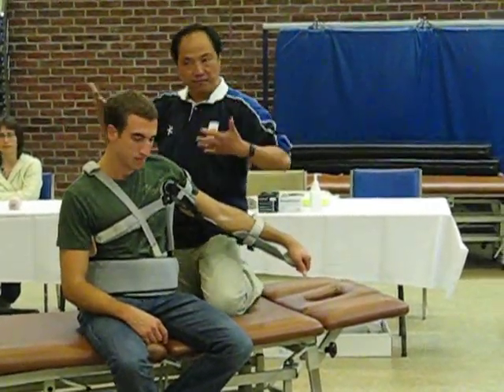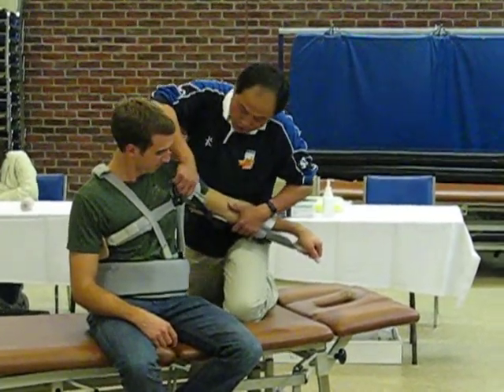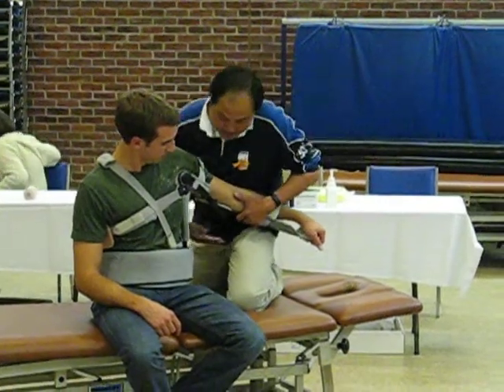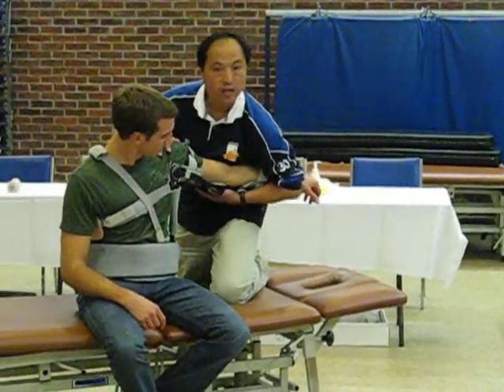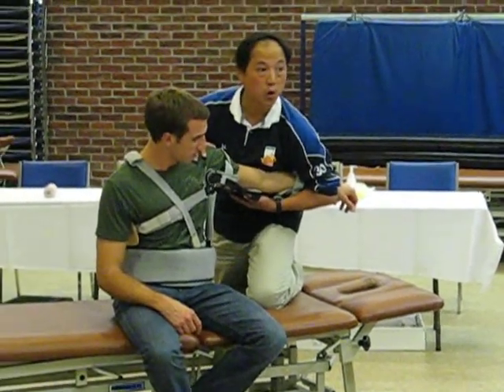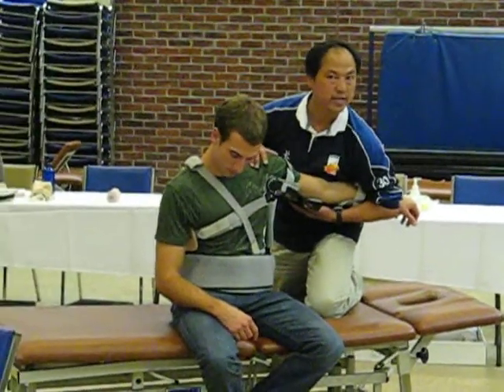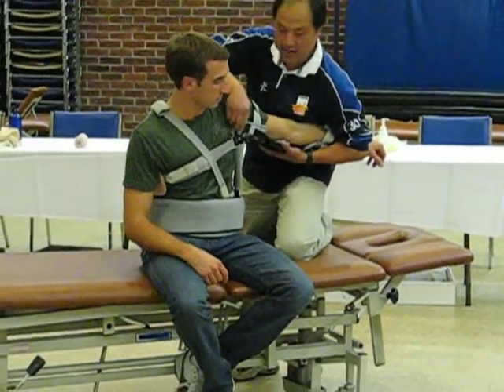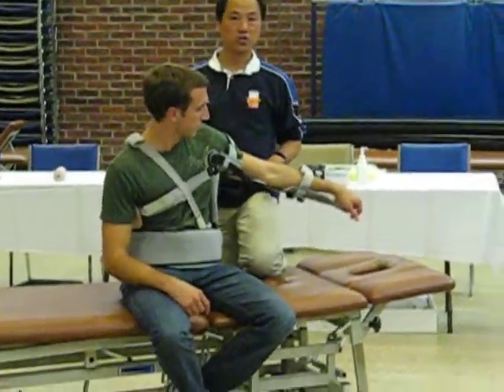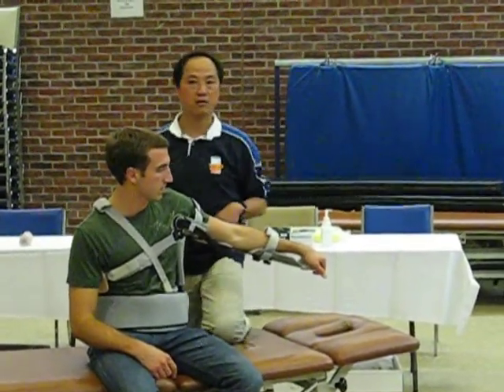After that, say 10 to 15 minutes later, if we find it's not too bad and we want to adjust — just unlock it and go slowly to where the patient can say 'yeah, that's about it.' You don't have to go all the way to the maximum. I prefer you go just to where you feel a little bit of tightness, and compromise with the patient. Lock it again. That's the way to go. The same idea: instead of progressive, we go for no more than an hour each time, three to four times a day.